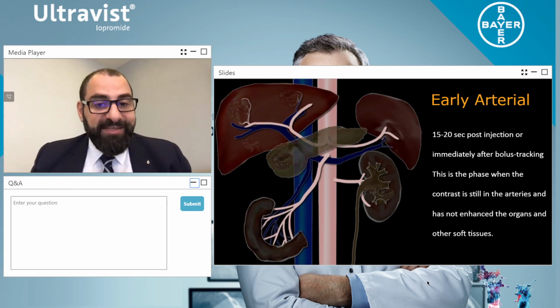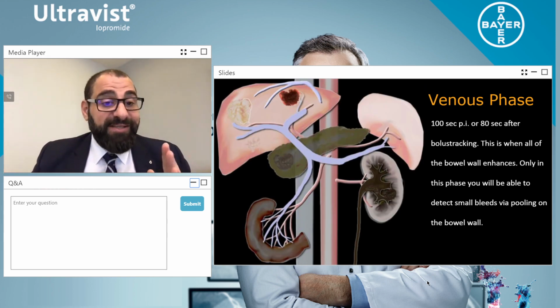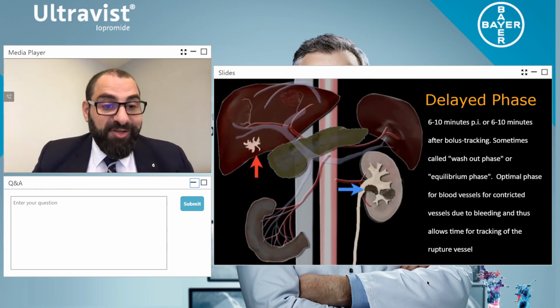If we look at the late arterial phase, this is where we've had contrast coming back. We've got good perfusion in tumors. Now remember, tumors are not just arterially enhancing. You can have complex arterial and venous enhancement. And then, of course, in the venous phase, we now have good contrast within the liver. The parenchyma is nicely and equally enhanced. There's also still contrast in the second circulation coming through into the liver, which provides superior quality. And then, of course, in the delayed phase, we get to see what washes in, what fills in slowly, or what washes out.